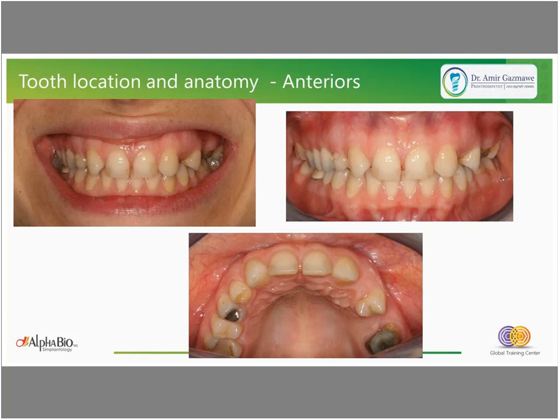In this case, we have congenital missing of laterals, and accordingly, we have also migration of teeth, you can see that we have at the left side of the maxilla, we have limited space for restoration, and we have also over-eruption of the posterior molar. With the extrusion of the tooth, we have also extrusion of the gingiva.